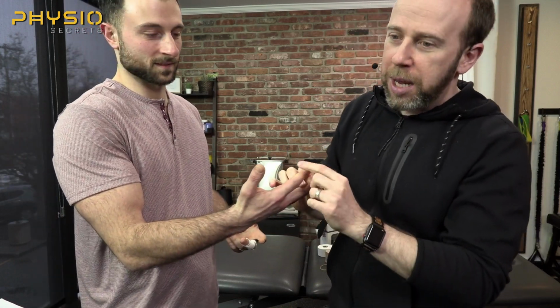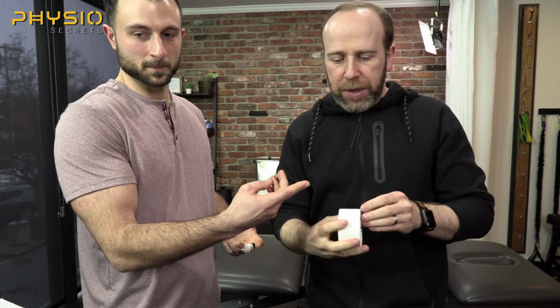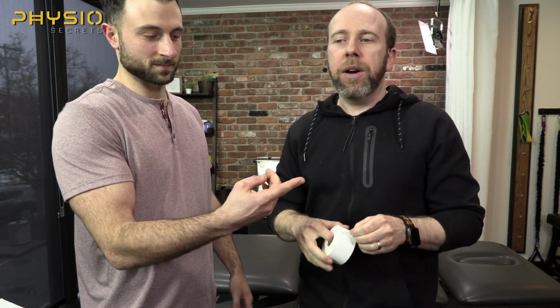Now let's go ahead and get this tape job done. So Dan Lin asked, how would you tape a finger to avoid hyperextension? This is a little bit like when Betty Crocker pulls the cake out of the oven and shows you the finished product. We're going to try to get this tape job done. It's a super simple tape job, and I just want to go over the principles. So I'm going to retape his right hand, and I'll tape his index finger so you guys can see. I'm going to tape him with athletic tape, just because it's easy for me to rip, and you can get a sense of what the concept is here.